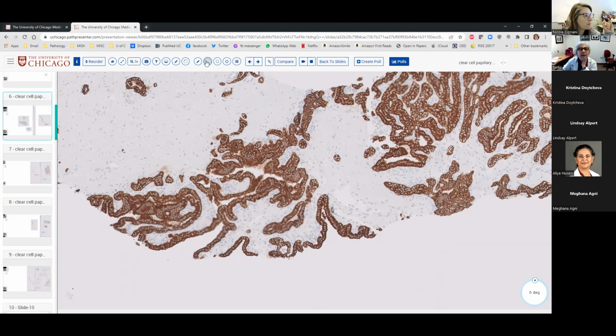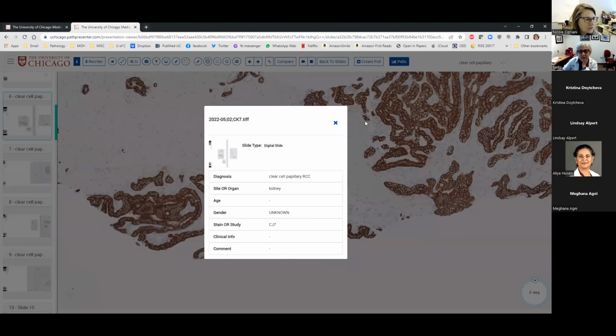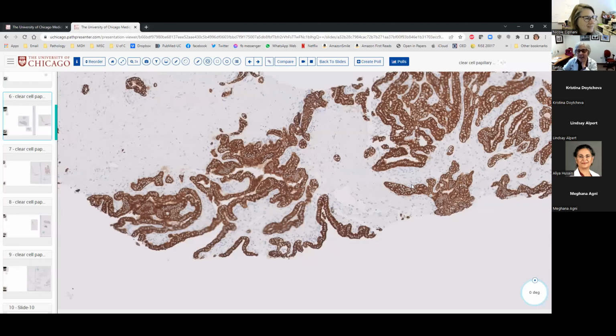Where is the eye? All the way to the left. All the way to the left. There. Next to reorder. Next to you. Yeah, the little eye. Oh, that guy. Oops, CK. Yeah, CK7. I kind of recognize this.